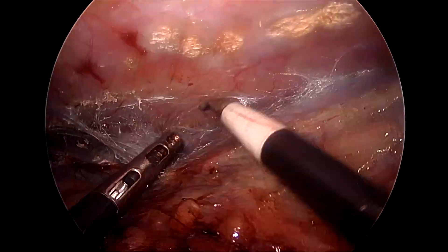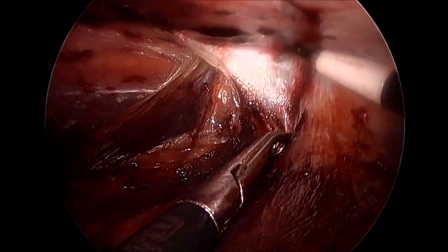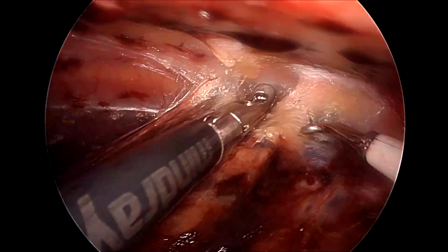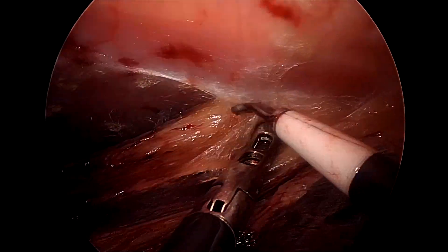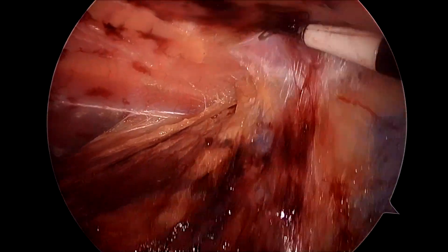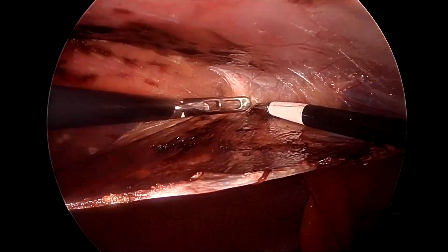The limit of dissection has to be guided by external compressive forces, and whenever you feel that you have done the dissection optimally, just dissect for a few millimeters or a centimeter more to place the mesh in a perfect way. Always try to recruit as much tissue as possible onto the peritoneal side to make a thick healthy flap.